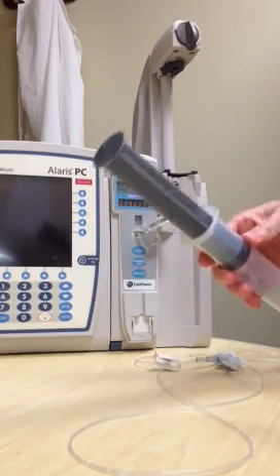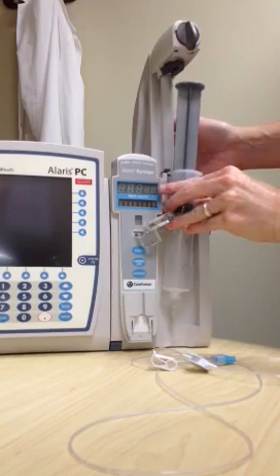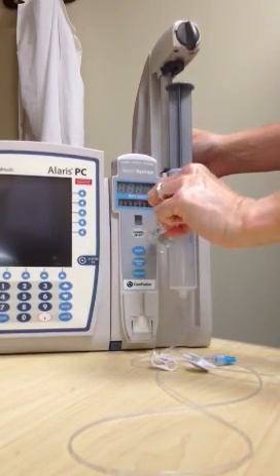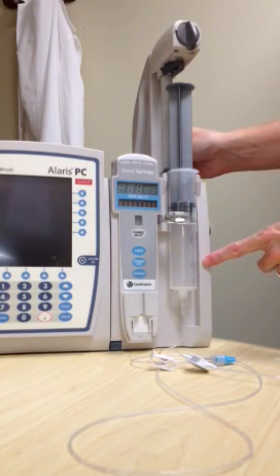To load the syringe, insert the syringe barrel flange between the barrel flange grippers, pull out the barrel clamp, twist it and release it so that it secures the syringe to the syringe pump.